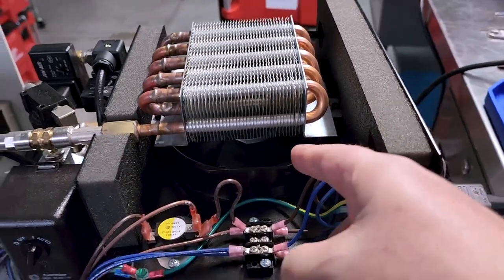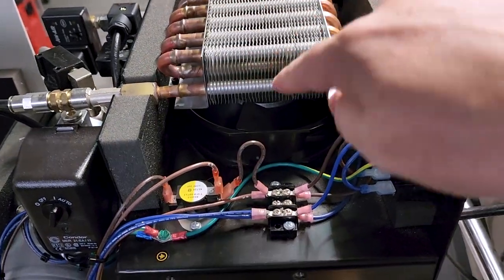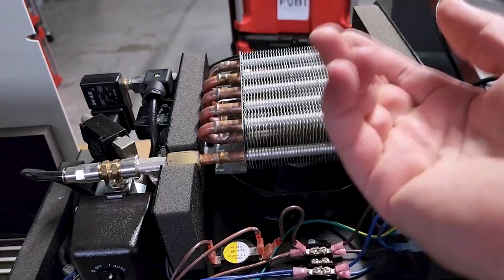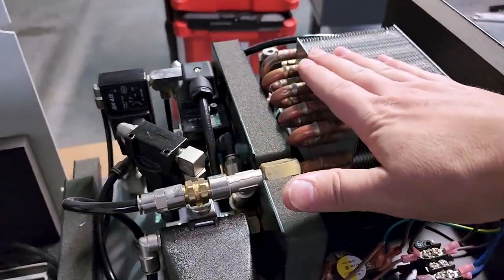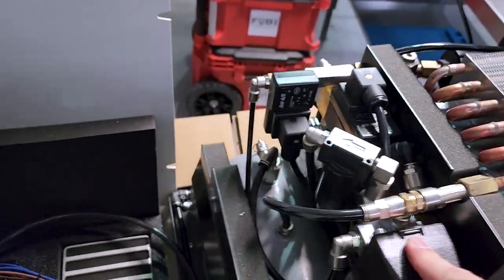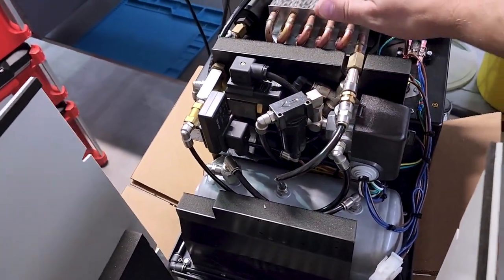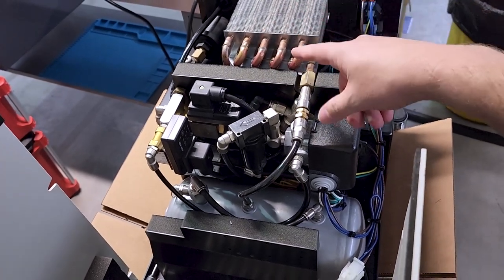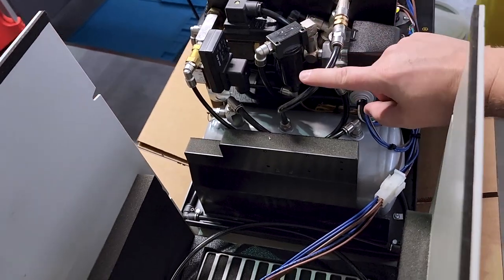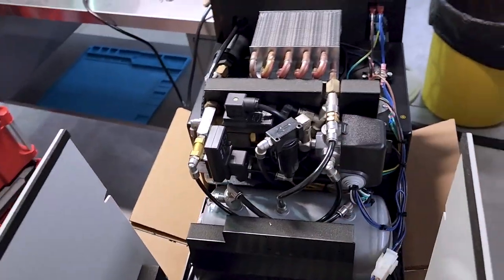So the compressor compresses the air. It goes up into this intercooler, which then uses some of the cooling air from the compressor to cool down the compressed air, where it goes down into your thermostatic valve and down into your reservoir. Now you want to condense as much as possible, because as you condense, your moisture is going to separate from the air, which is going to be a good thing, because the last thing you want is this guy to be blasting out moist air.